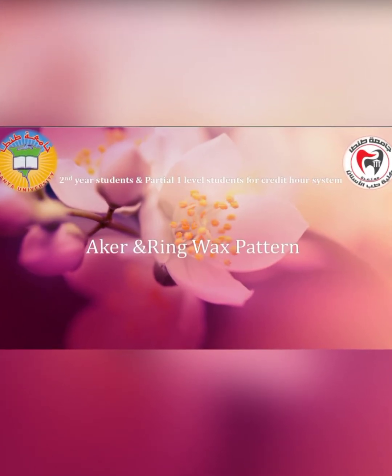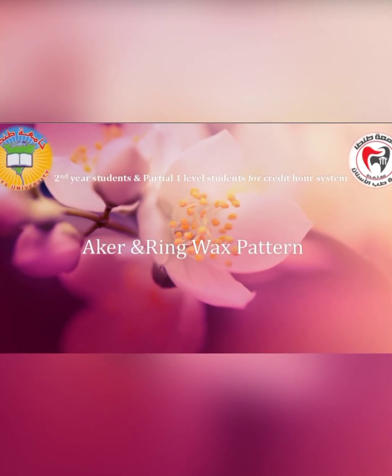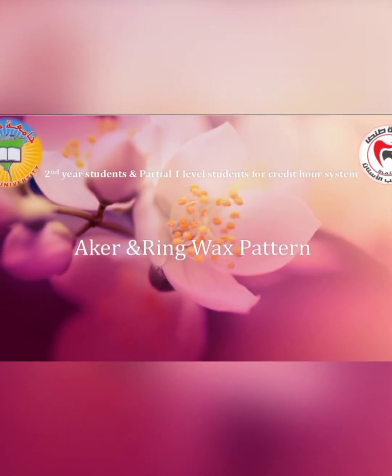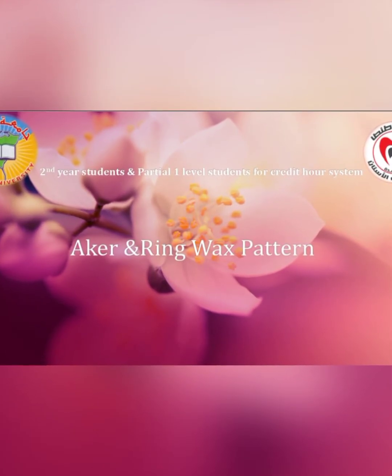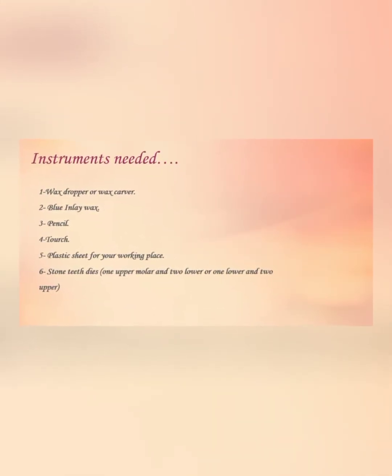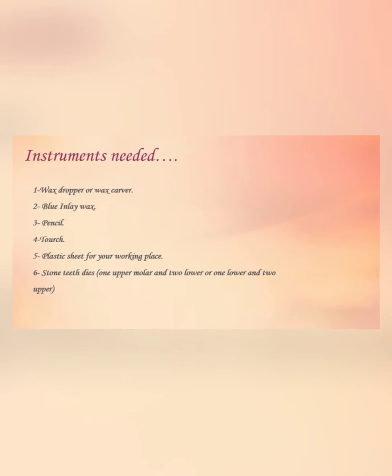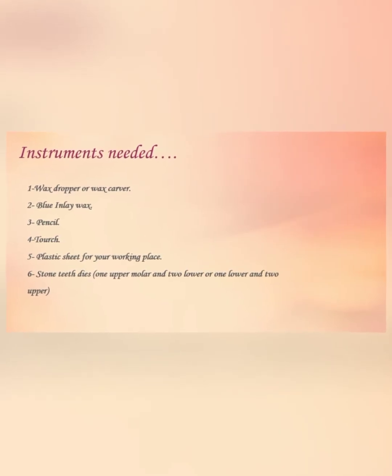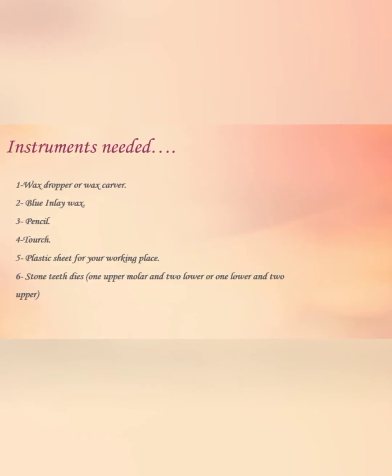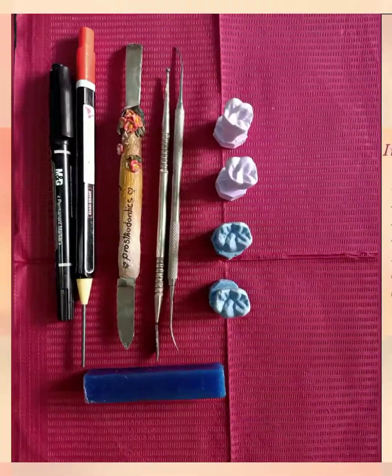Welcome to our practical session for second year students and partial one level students for credit hour system. Today we will speak about Akers and ring clasp wax pattern. You will need a wax dropper or wax carver, blue inlay wax, a pencil, a torch, a plastic sheet for your working place, and of course your stone teeth dies.